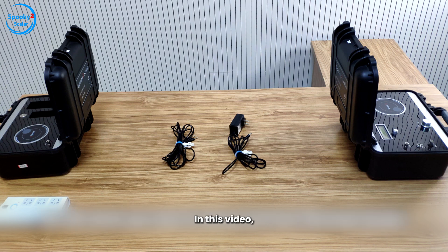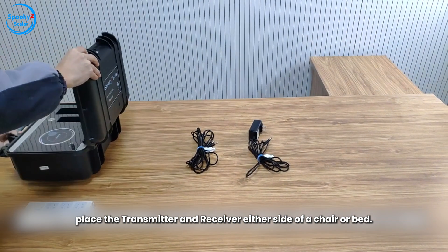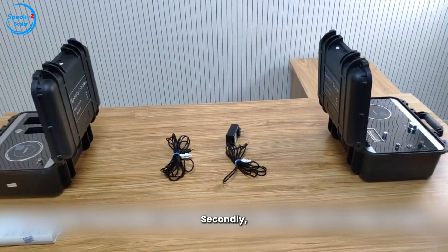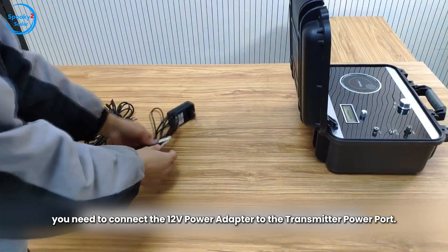Hello everyone, in this video we will show you how to set up and tune Spooky 2 Scaler. First of all, place the transmitter and receiver either side of a chair or bed. Secondly, you need to connect the 12V power adapter to the transmitter power port.